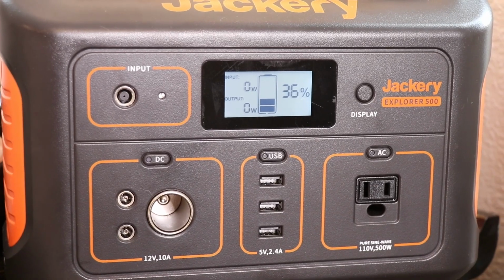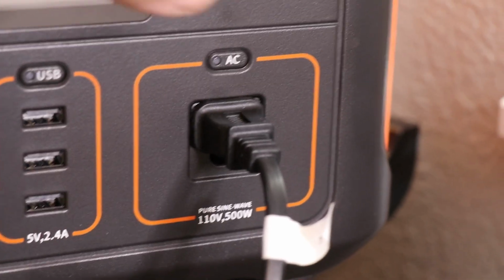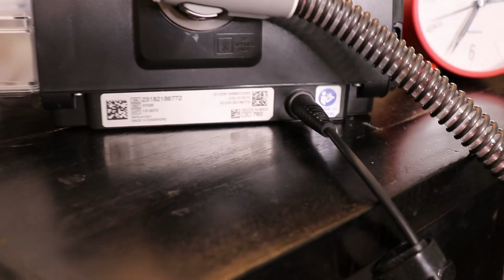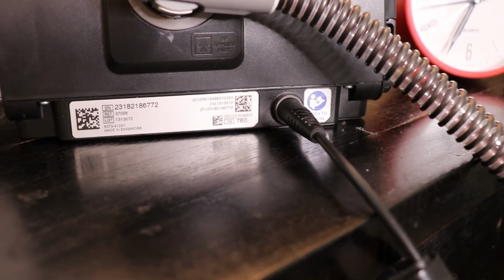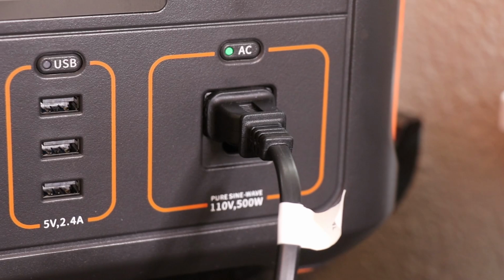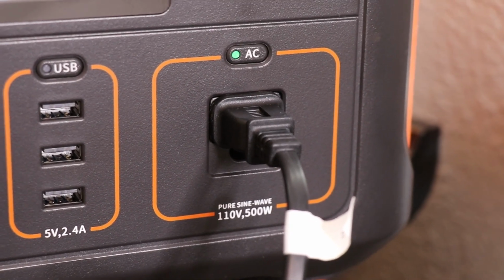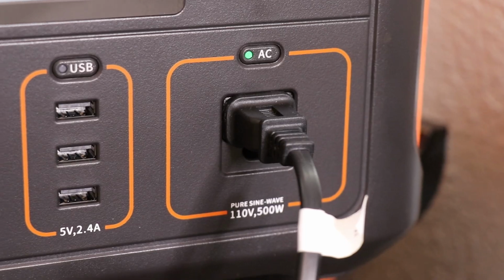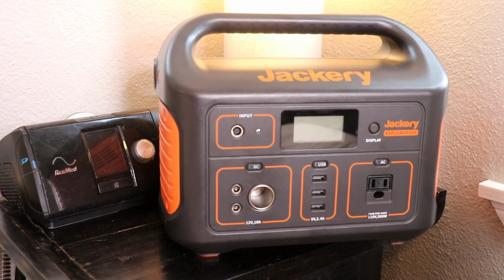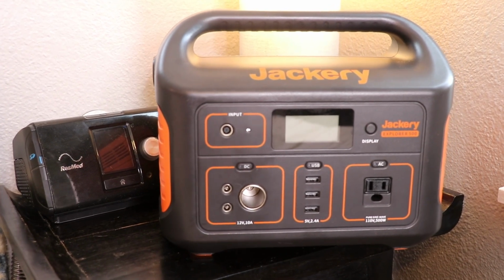The Jackery Explorer 500 has a few different outlets that you could plug into. You could always just plug directly into the AC outlet like you do normally, but that's actually an inefficient way of powering your CPAP. If you were to plug it into the AC port on your Jackery Explorer 500 and not make any adjustments to the actual CPAP machine itself, you only really get around 22 hours of power. So that will allow you to sleep for 7 hours a night for 3 nights. During my testing with this setup, I found that you lose around 4.5% per hour of your power. So yeah, it will get you through 3 days of a power outage, but it won't get you through a week.